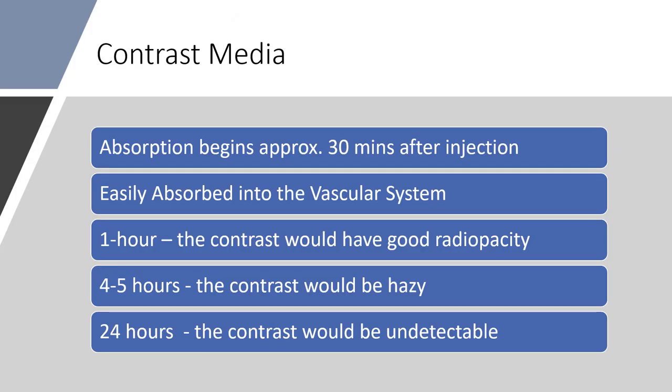Contrast media absorption begins at 30 minutes after the injection. So you really want to have everything ready to go and get your images in this window. Absorption begins at 30 minutes after injection. It is easily absorbed into the vascular system.